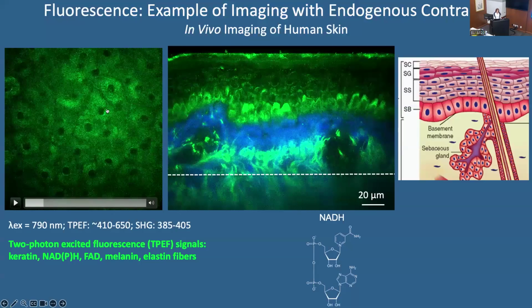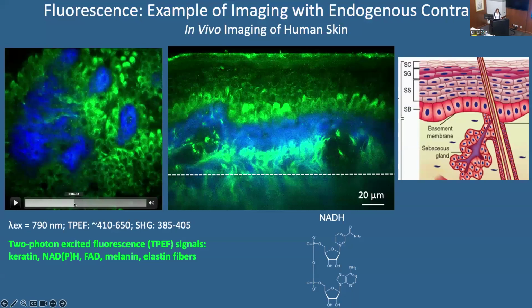So these are all keratinocytes we capture beneath the skin surface. When we use intensity only, the melanin is much brighter compared to the other fluorophores. So this is what you see in the brighter cells here. And these are the tips of the dermal papilla. That's the name for these protrusions of the dermis into the epidermis. That's that undulation I mentioned earlier.